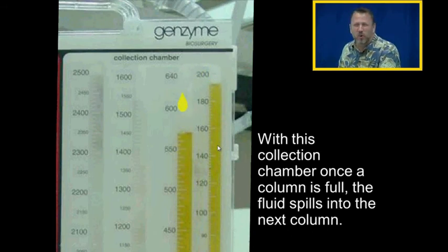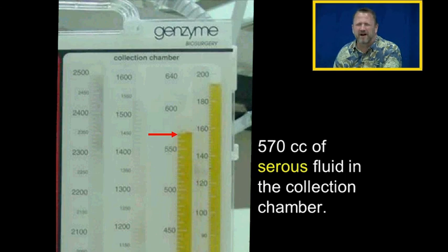And so that's why the more advanced, more complex collection systems have these different columns. And here we have 570 cc's of serous fluid in the collection chamber.